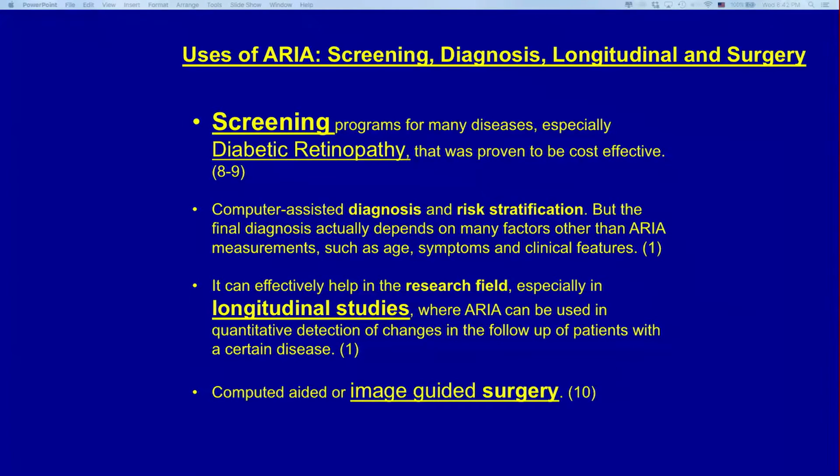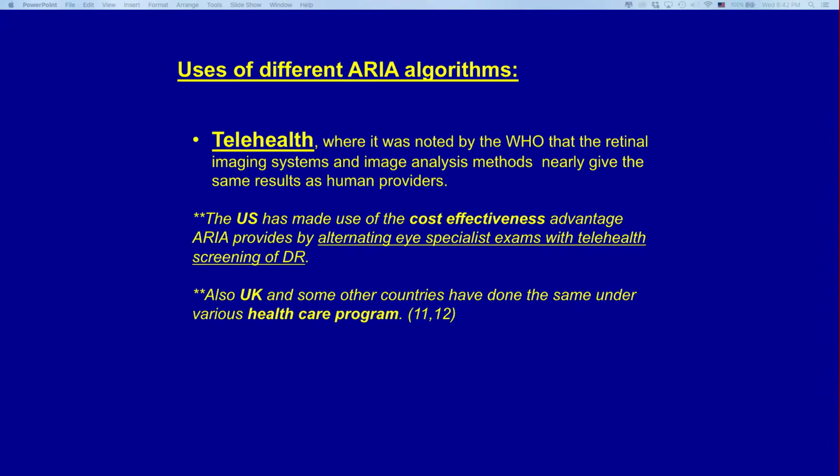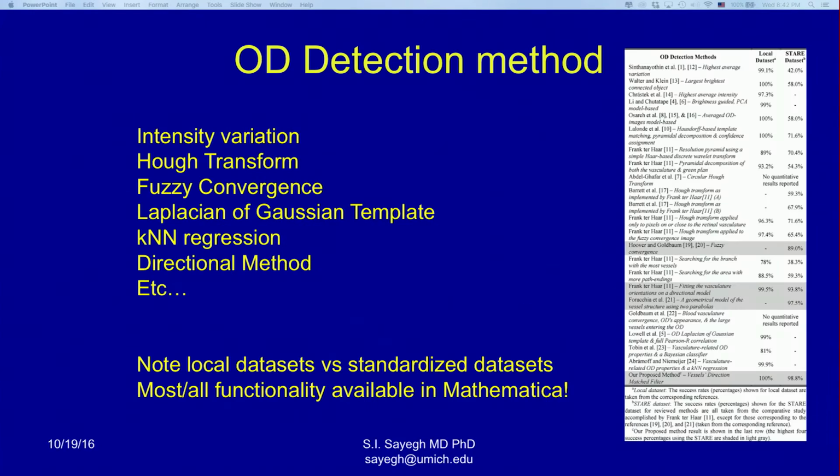You want to do longitudinal studies, or you want to even follow your patients today, in 1 year, in 5 years. You want to see how things are and then compare. And you may want to be looking at some kind of image-guided surgery for some applications. Okay, so telehealth is very important, and there are examples of that.